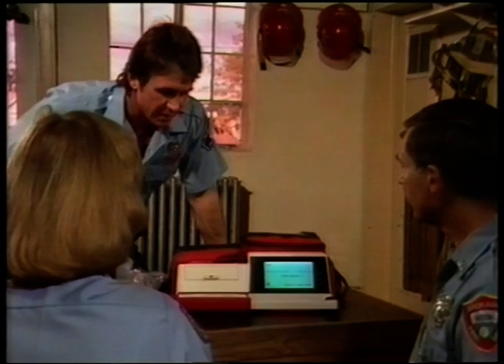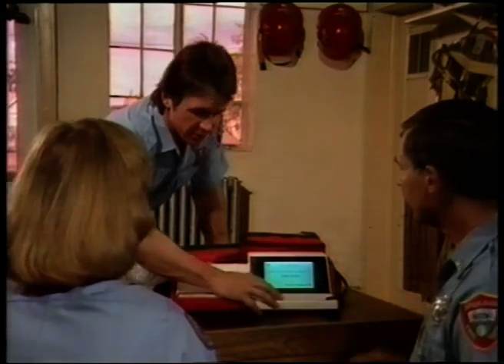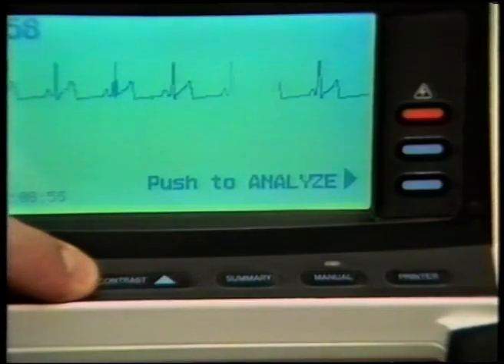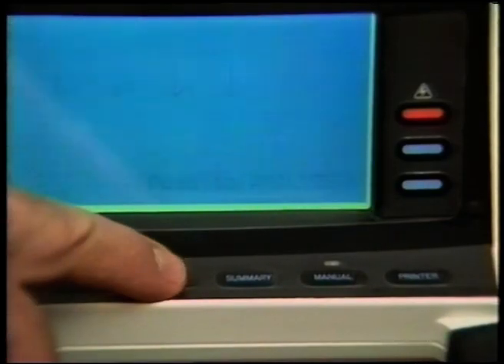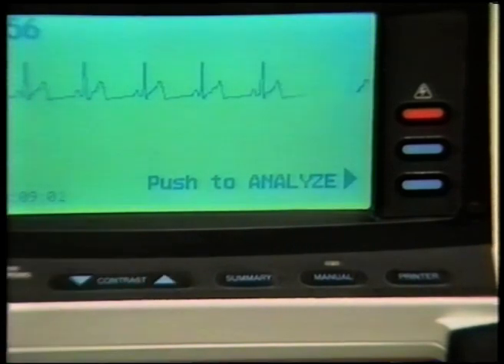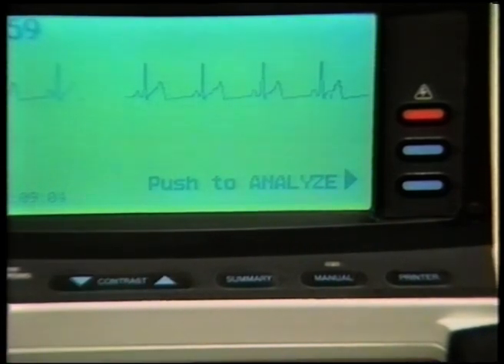The LIFEPAK 300's display is a backlit liquid crystal display. Liquid crystal displays, or LCD for short, perform differently in different lighting situations and at different viewing angles. If you need to improve the display's viewability, the contrast may be adjusted by pushing the Contrast up and down buttons.